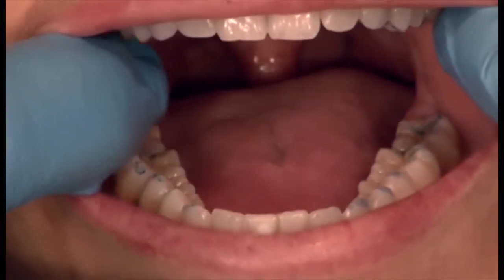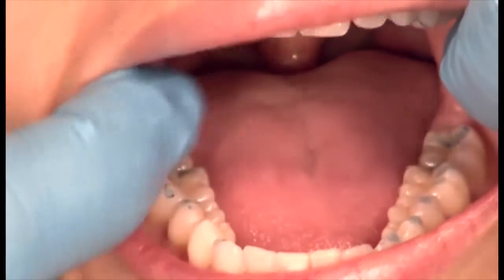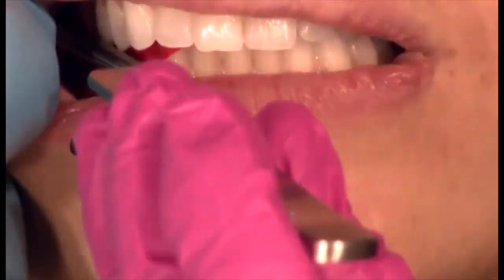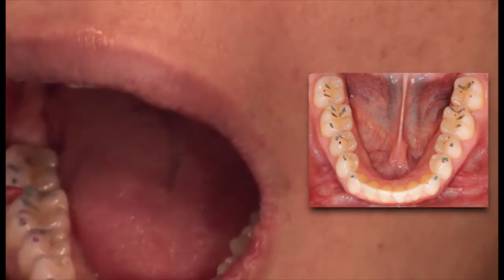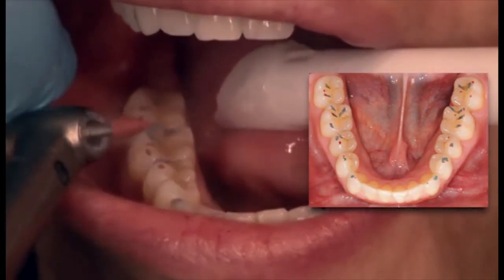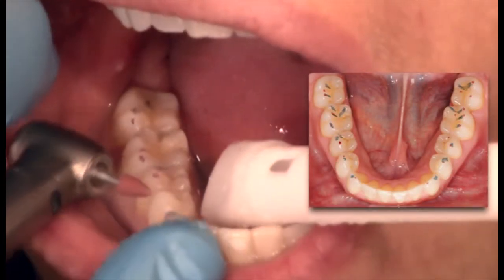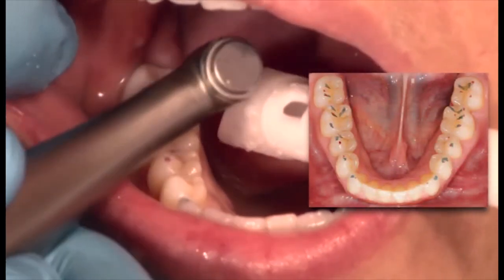You can see the blue streaks on the posterior teeth. And so I'm going to remark the holding cusps. Let's take the red paper. Tap up and down. Open. And on my side. Okay, open. So what I'm going to do is not touch any red dots, only the blue marks. So I can take all of the blue away, but none of the red away. So this won't change the feel of the bite. It only changes and reduces the risk of chewing interferences.